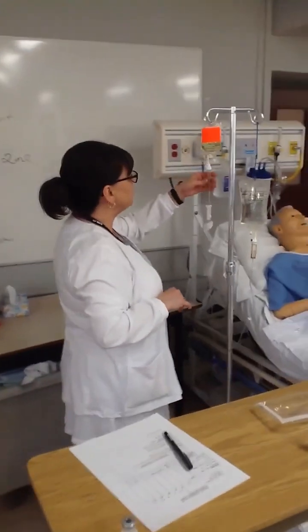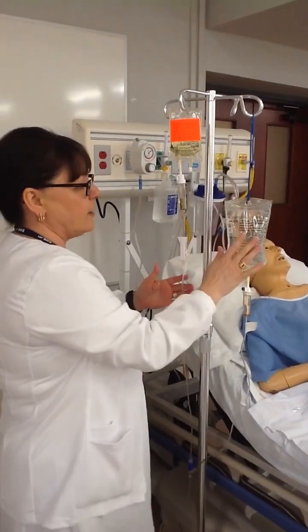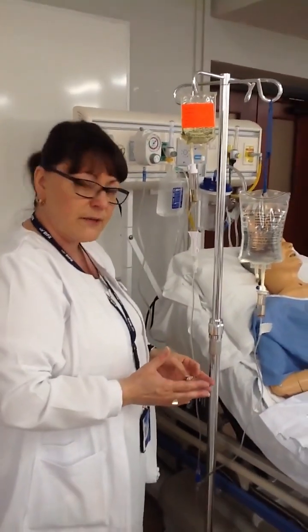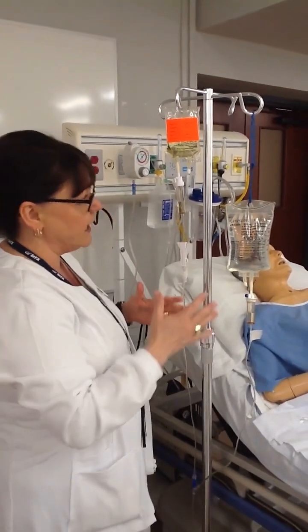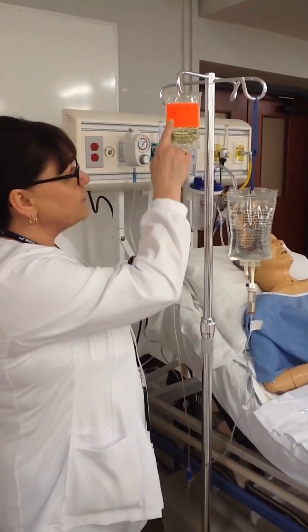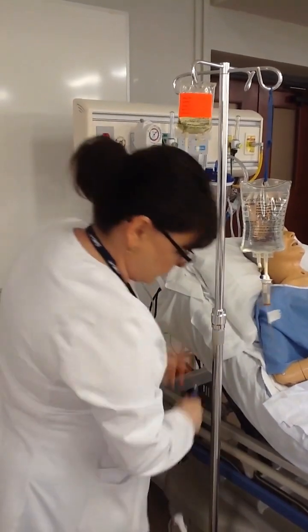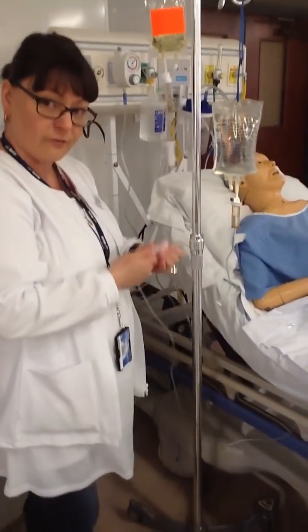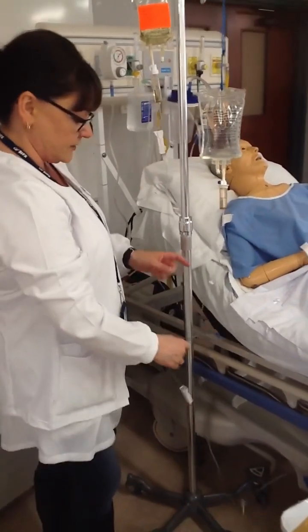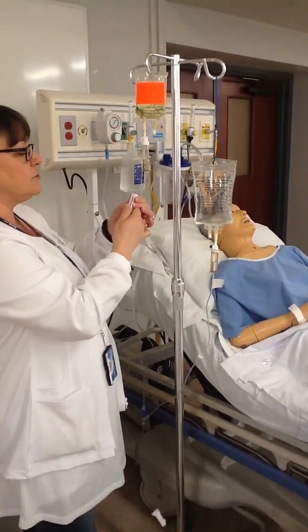And so I'm going to come over here again. Everything is all connected. I've dropped down my primary, so this is the one that's going to flow. There's one more bit of important information you need to understand when you initiate a gravity feed. The roller clamp for the secondary bag, the medication bag, has to be turned on all the way. So your primary is completely shut off right now. That's the 100-inch primary tubing. That's shut off. Your secondary or your piggyback set roller clamp, you turn on all the way.